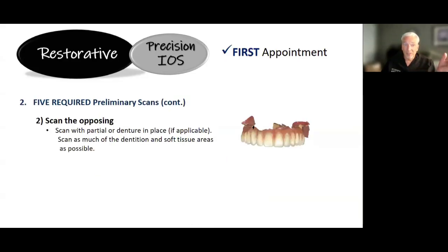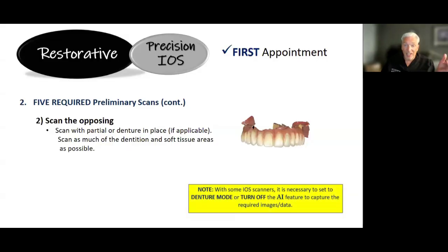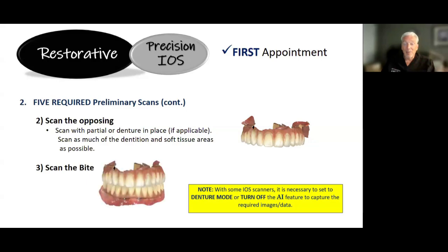So that was the scan of the working arch. Scan the opposing, okay? Scan the bite, and you're going to find, I'll just share this with you now.